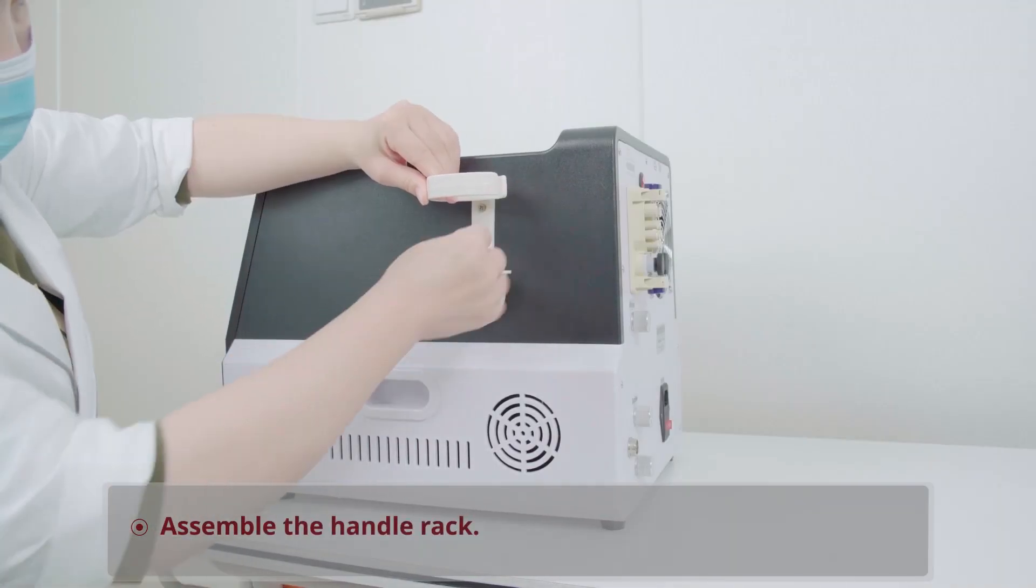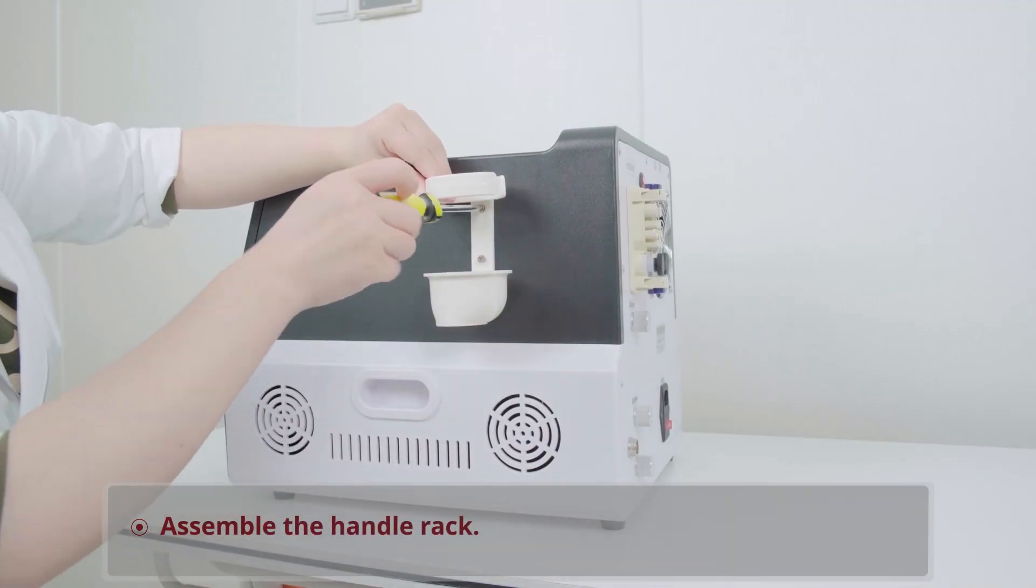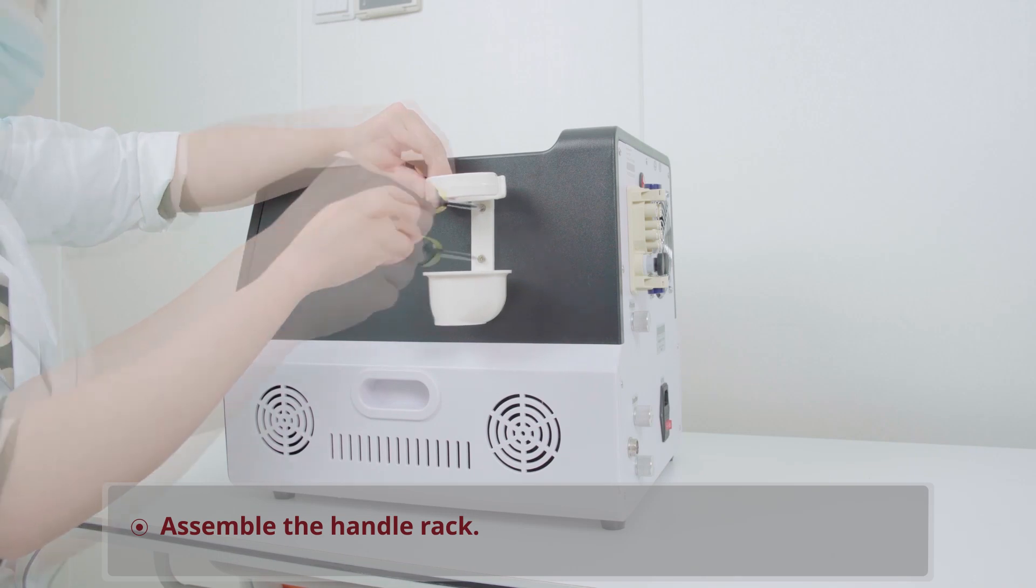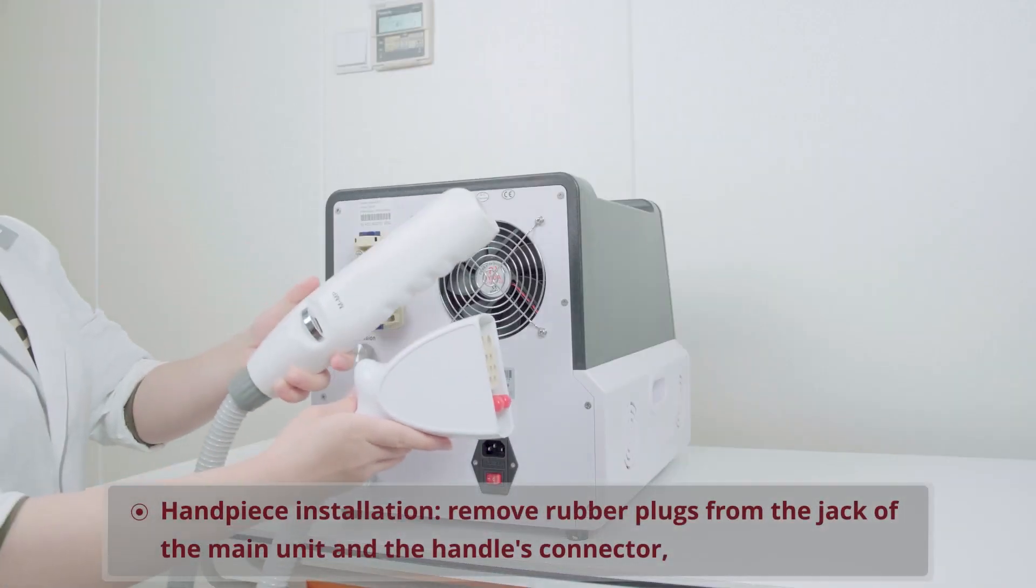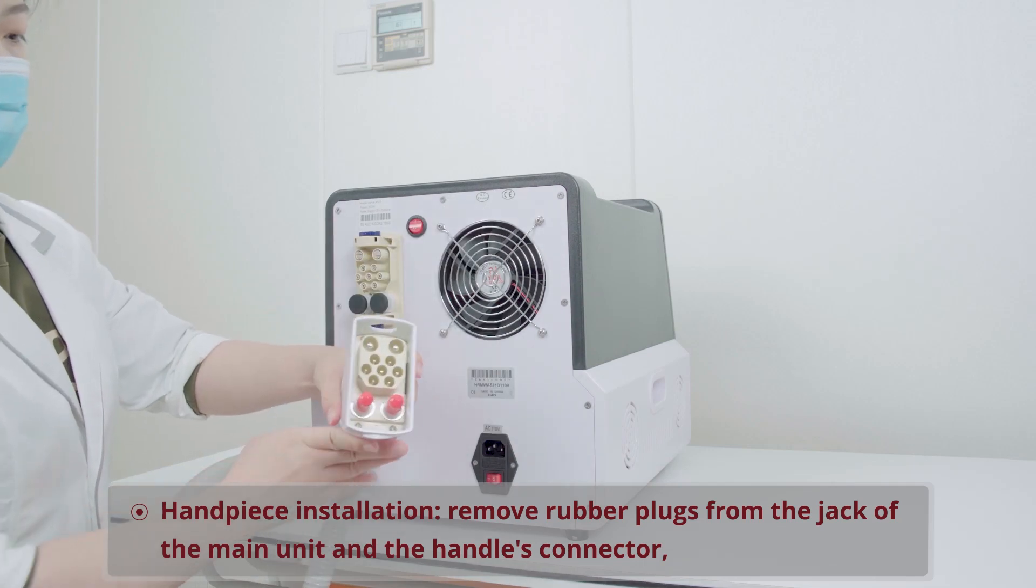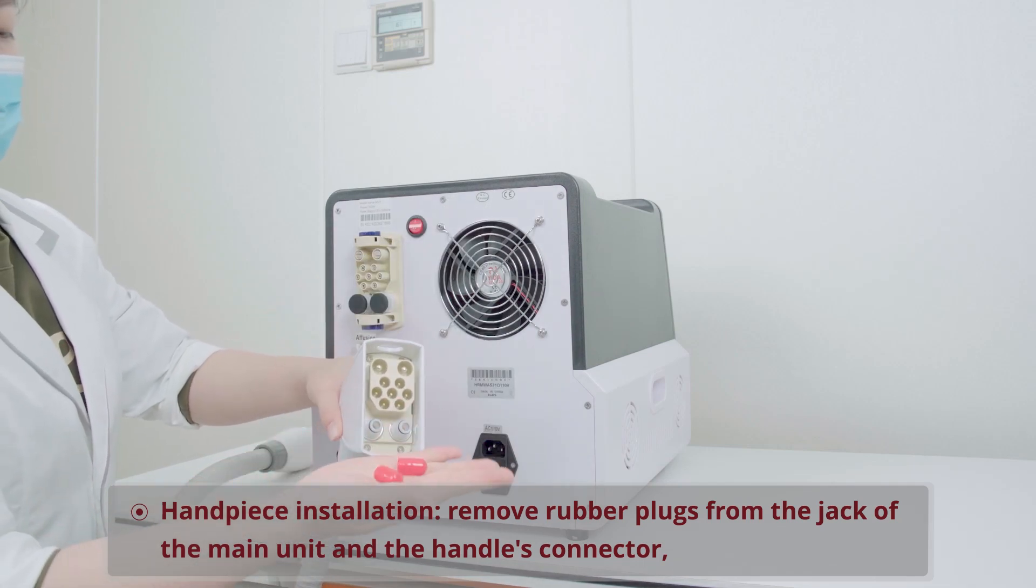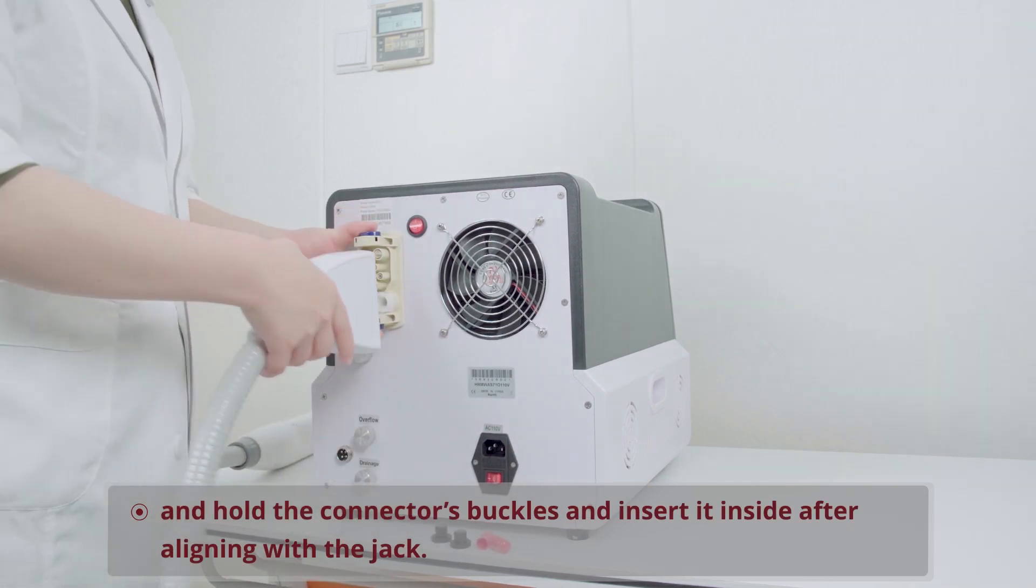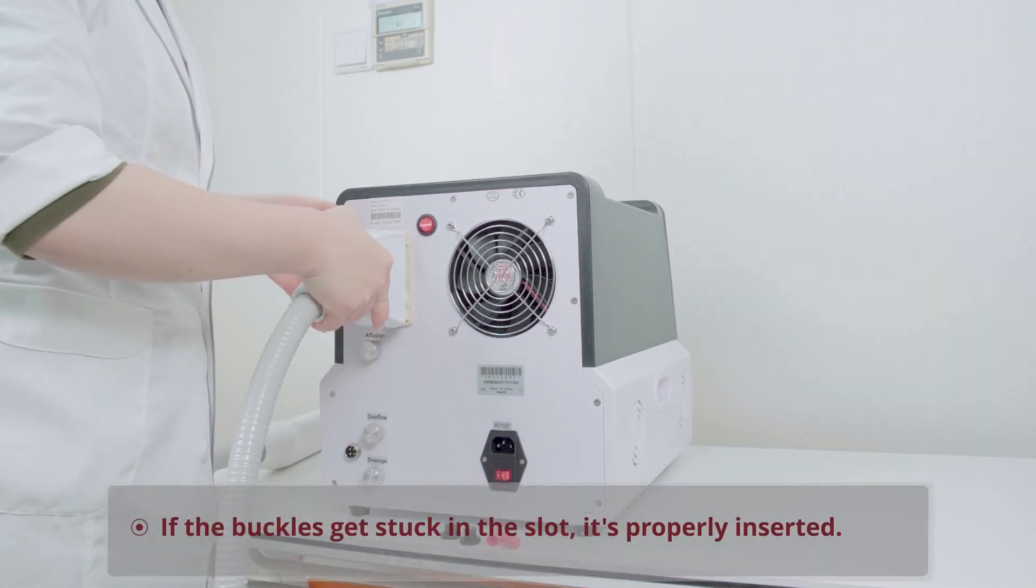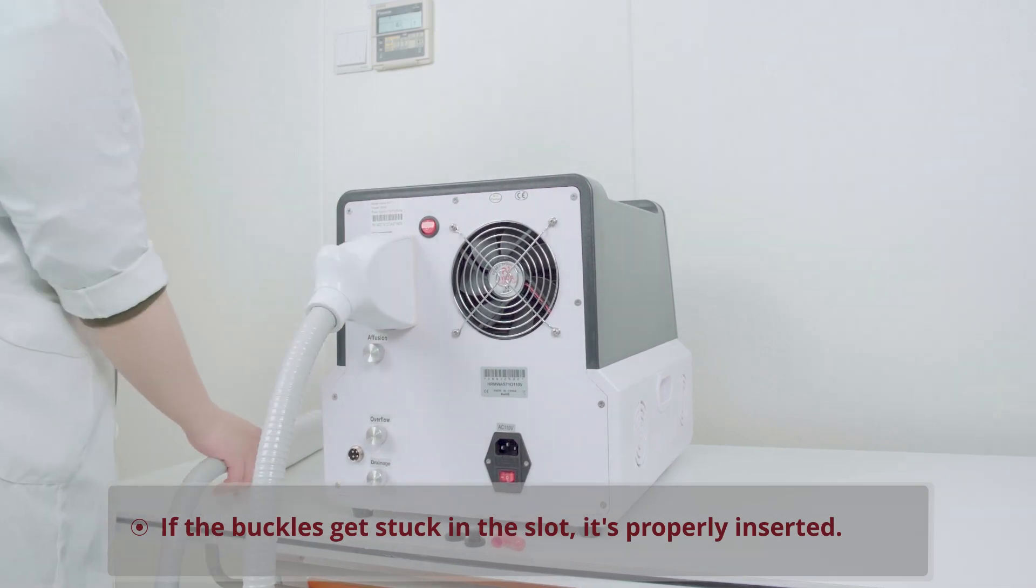Assemble the handle rack. Handpiece installation: remove rubber plugs from the jack of the main unit and the handle's connector. Hold the connector's buckles and insert it inside after aligning with the jack. If the buckles get stuck in the slot, it's properly inserted.